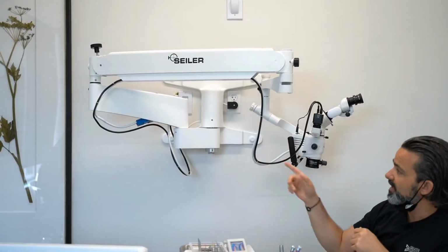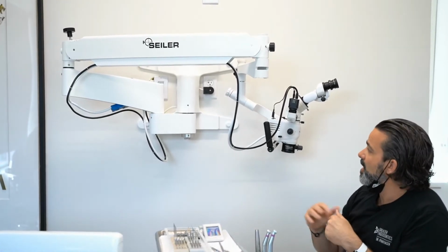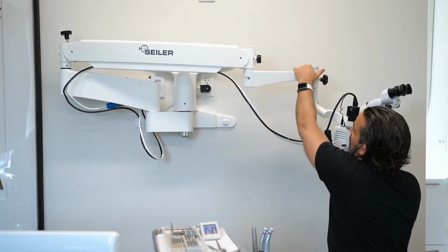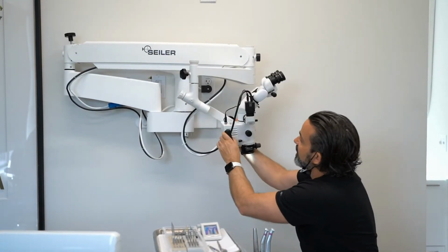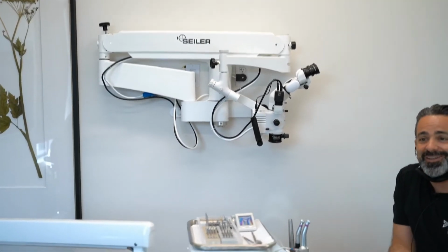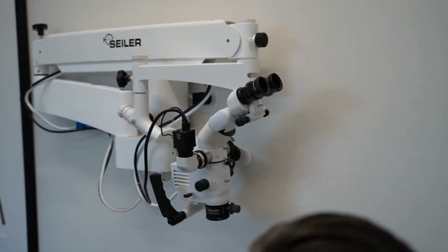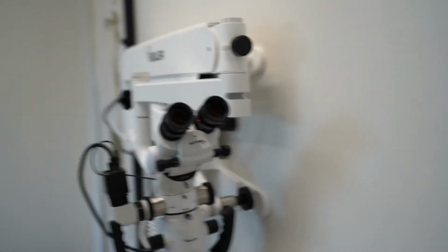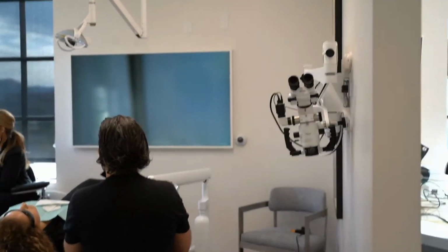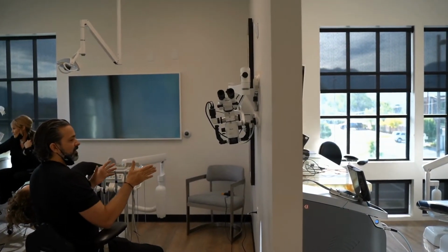And other than my dangling cords that are going to be changed out here, ergonomically, I'm kind of vain. If you walk around my office, you'll get why I'm vain. But I like my microscope tucked up like that, nice and tidy on the wall. Let me get a profile shot of that. So people can walk into that chair.